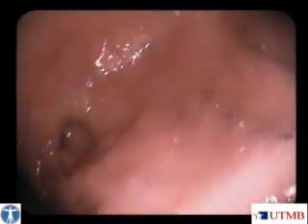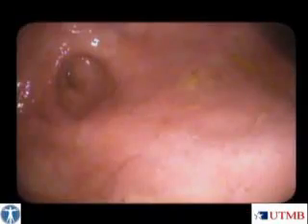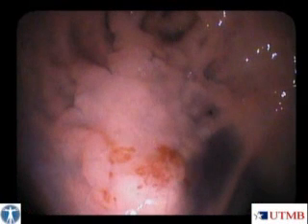The following video demonstrates a depressed colonic lesion. This patient had previously undergone 3 yearly colonoscopies with poor preparation in the right side of the colon. Note that the base of the lesion lies below the level of the surrounding mucosa. Notice the characteristic irregular lining and the altered vascular pattern. Again, these details are much better appreciated after instilling indigo carmine.